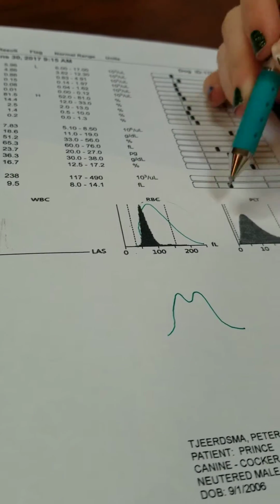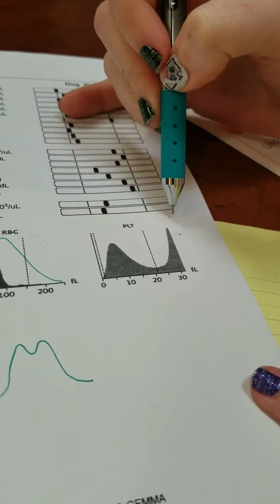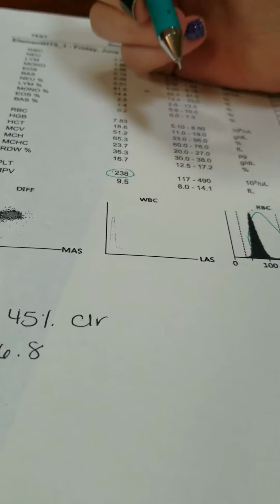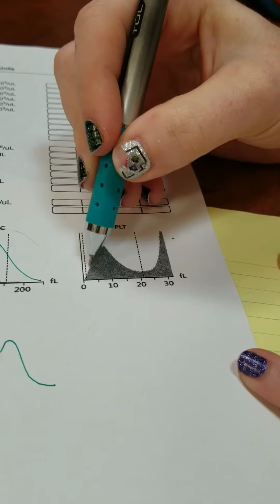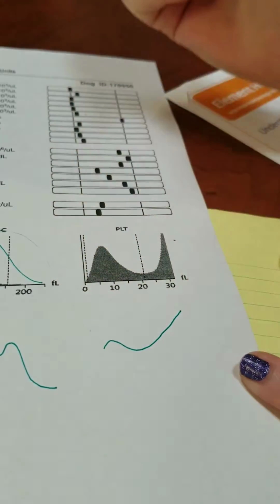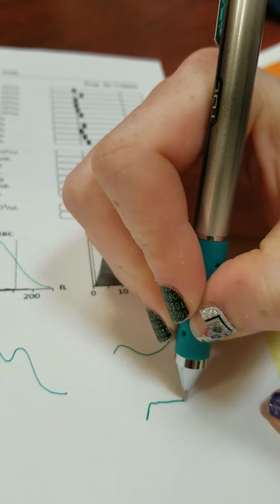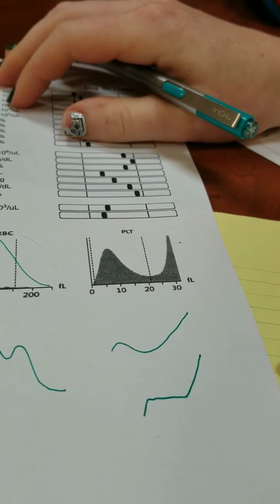Great. Your platelet histogram is my favorite one in the world because this is great for cats with the notorious platelet clumping problem. And if you get a low platelet, so let's say that this number was 50, and it was a cat sample, if you had a lovely curve that looked like this, or that was a little bit narrower but still was an obvious curve, I would say that that was a true low platelet count. If it does something that goes more straight in this direction and then straight up, that's more indicative of a platelet clumping situation.